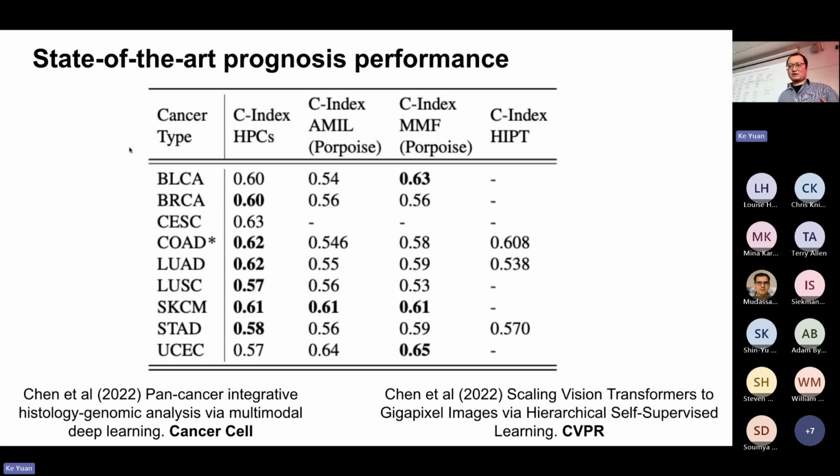Which begs the question about what the predictive signals in those large slices really are. Do they actually exist in the localized tiles, which is really what multiple instance learning is trying to get, or is it actually much larger tissue architectures at play here?